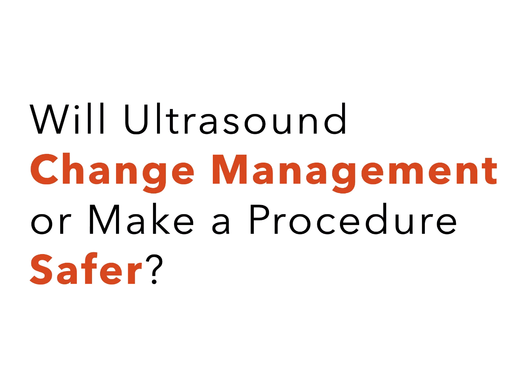Finally, before you take the machine into the room, ask yourself, do I have a clinical question that ultrasound can provide a useful answer to? Do I need to do a procedure that is safer with ultrasound guidance? If your answer is no to these questions, then don't scan the patient. This is not the time to be doing practice scans or scanning just for fun.